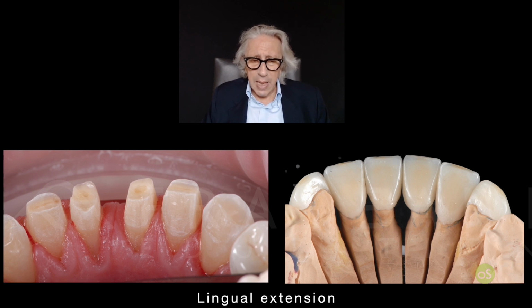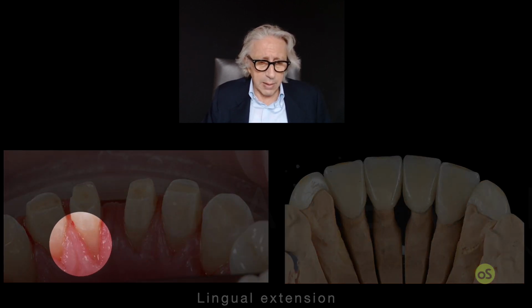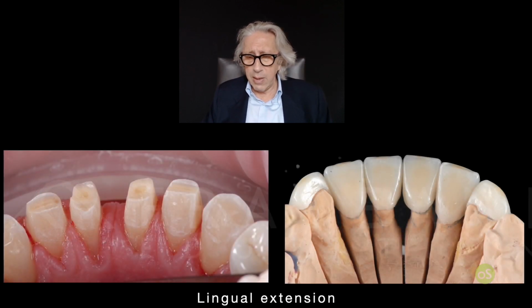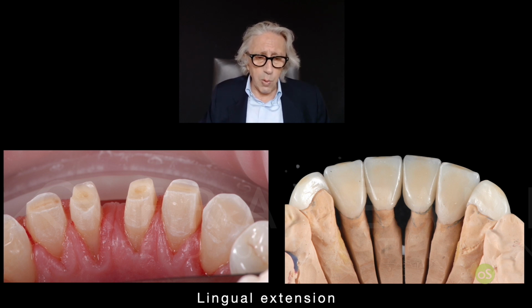We want to keep the preparation until the enamel and cement enamel junction. Then you have a recession over there, so we didn't follow the preparation up to this area, but just where the enamel ended, but we can cover it with very short teeth. Remember, it has like 4 or 5 millimeter length, it should become 9 millimeter. So that's the reason why we decided to cover partially also the lingual part with the full veneer.